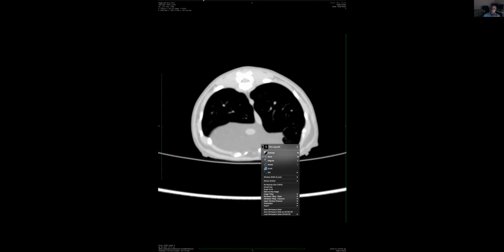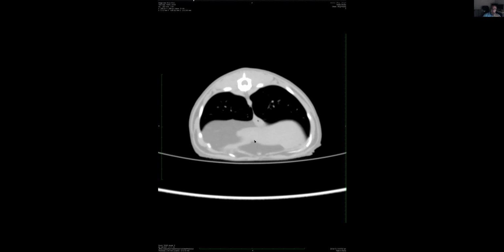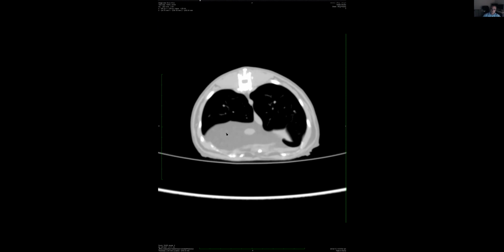Makes sense? So in a radiograph, because there is this problem of the thickness, the attenuations or the opacities sometimes are confusing, because if you have a lot of fat, it looks like soft tissue, and that's confusing. CT is just brilliant. Like here, that's liver, that's fat. It's very different. Makes sense? So this is clearly fat, and it's not in.